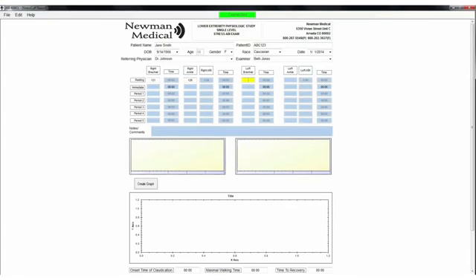If claudication occurs, note the time as well as the time of onset, severity, and total walking time. Note whether it was claudication that stopped the patient or some other cause.